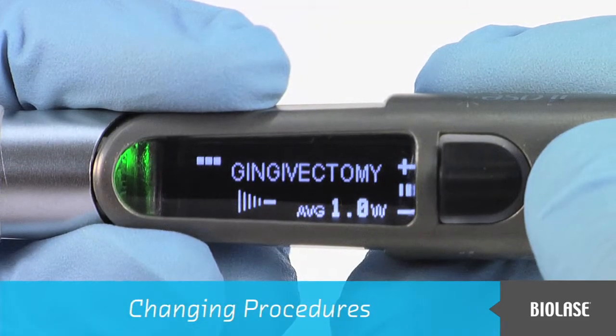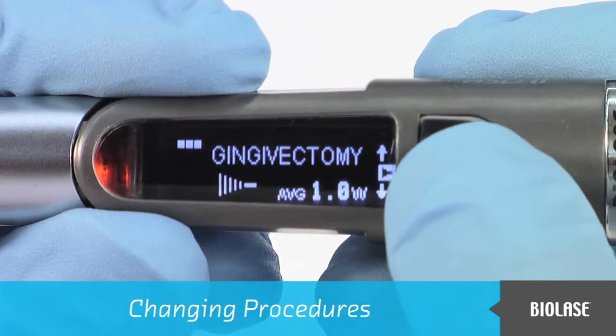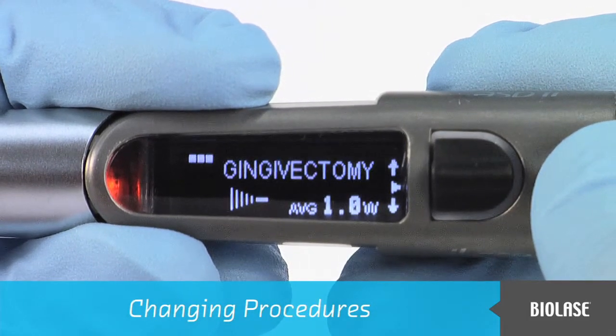To change procedures, first enter standby mode. Then push the black navigation button up or down until the name of the procedure is highlighted.